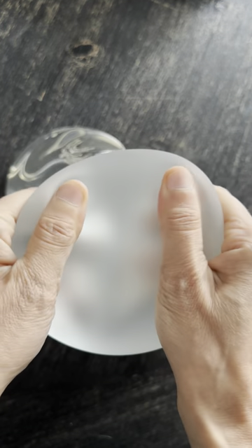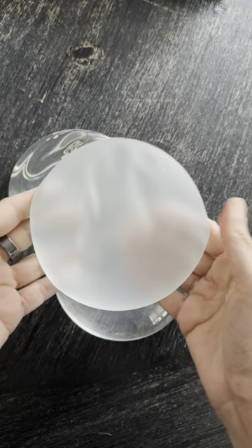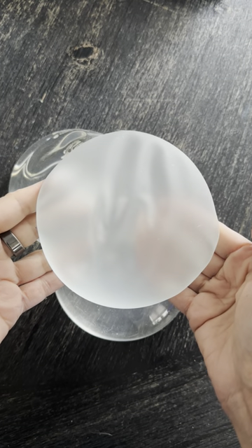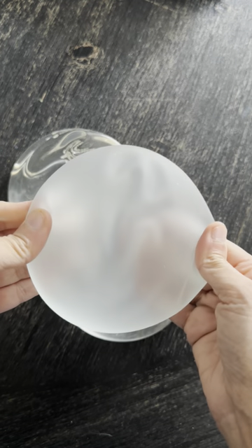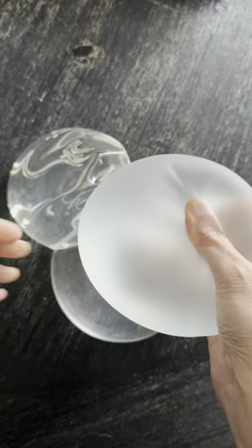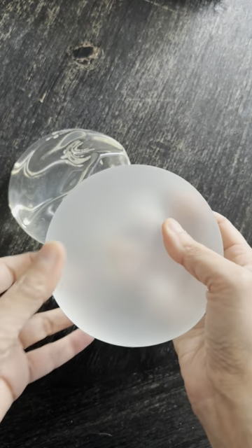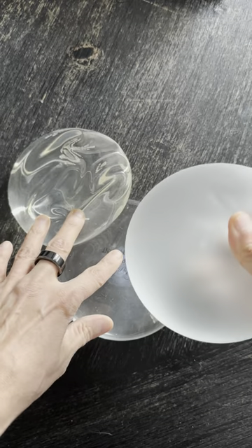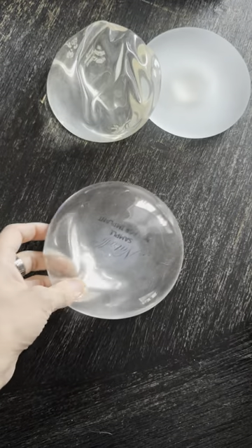It feels very smooth but it has a nano-textured or micro-textured surface, depending on how you'd like to discuss it. I'm going to do another video just about this implant because it was just approved by the FDA for use in the United States about a month or a month and a half ago. So it's still a new implant — I haven't used it in any patients yet — I'm still reading about it and learning about it, but I'm really interested to see what it looks like from the inside.